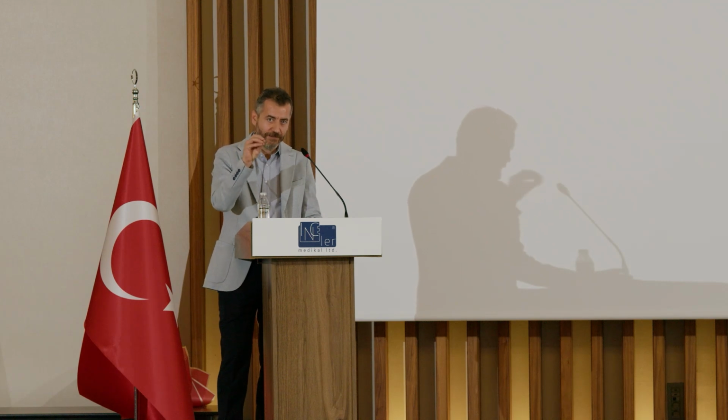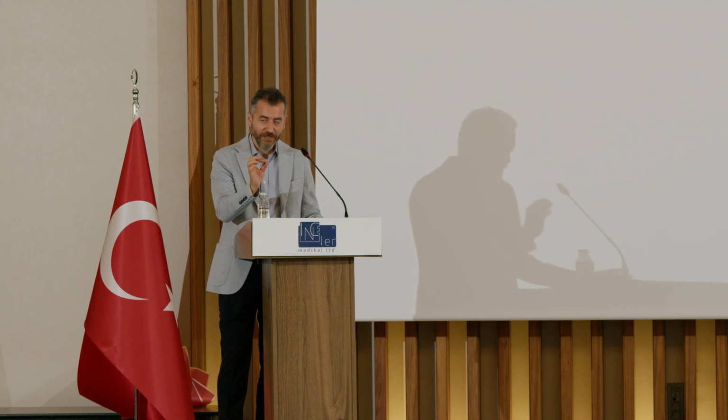And in the end, as I cannot suck out the dust with the tiny ultrasonic probe, I just fragment instead. I just use the ballistic one because the ballistic probe is 4 French in diameter, so it's better compatible with my working channel. So in the end, I just fragment without sucking. I fragment and take the pieces out, and it's actually a wonderful procedure.